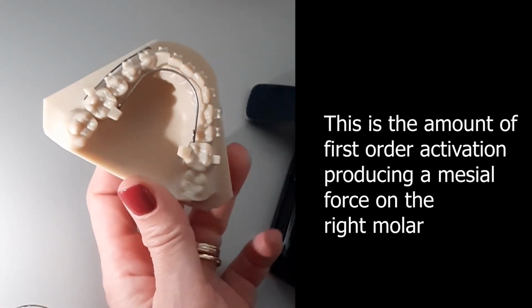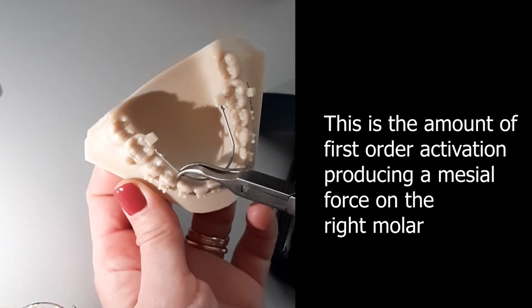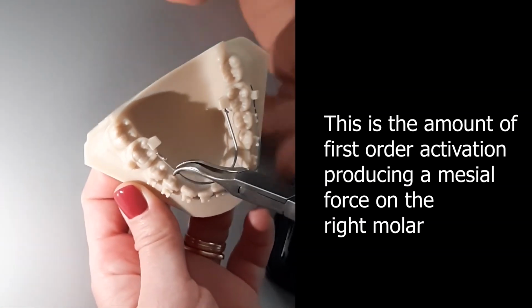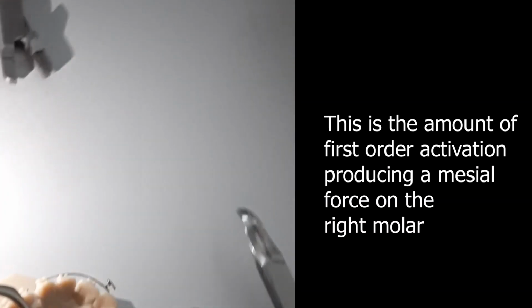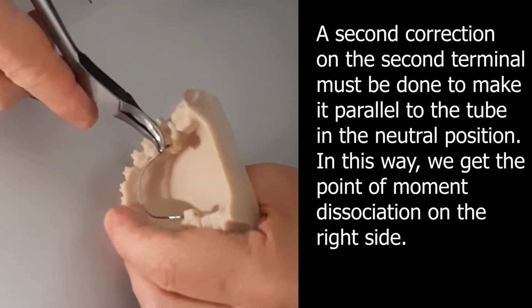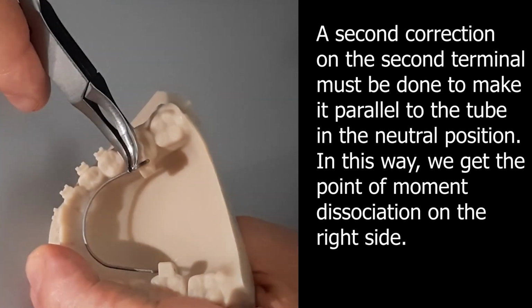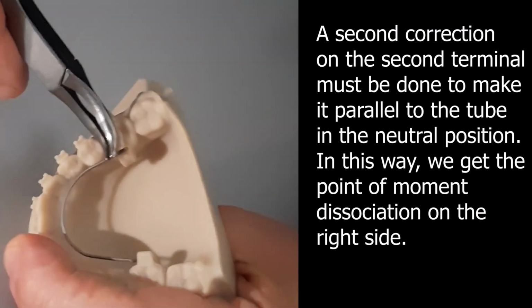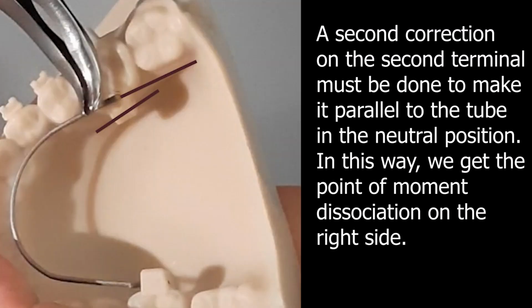And it's at the same level. Okay. Are you filming? The other thing is that you should check. Now the transversal might be okay. If I do this, I have to check from the occlusal view that there is no angulation between the tube and the terminal part. Unless you want it, but then everything becomes difficult. You cannot do everything at once.